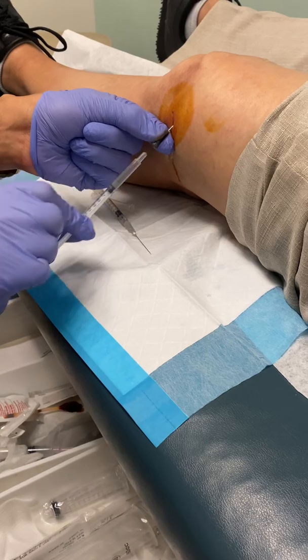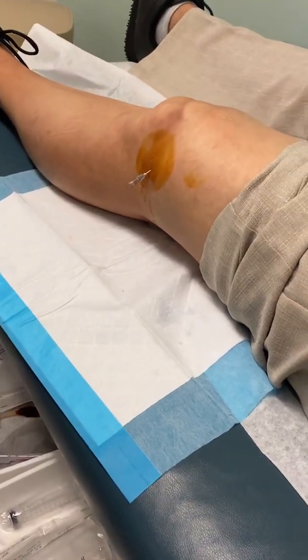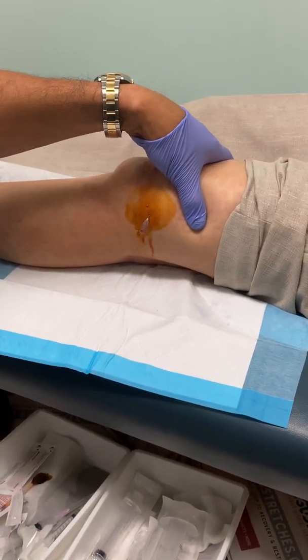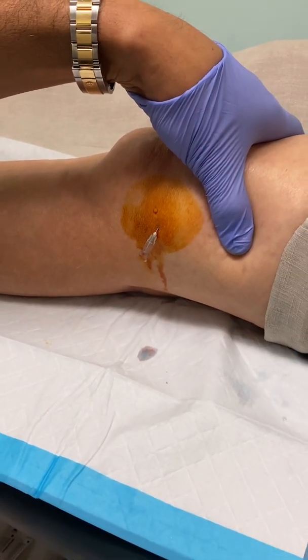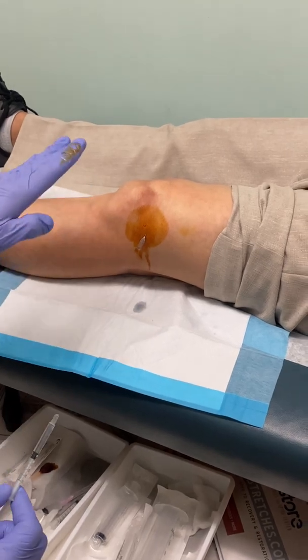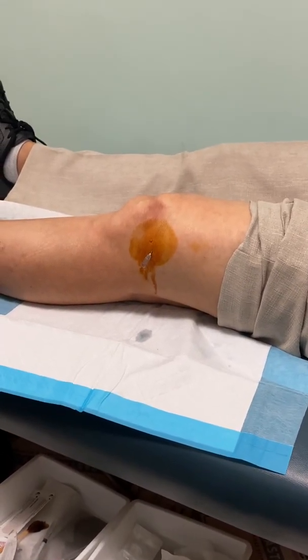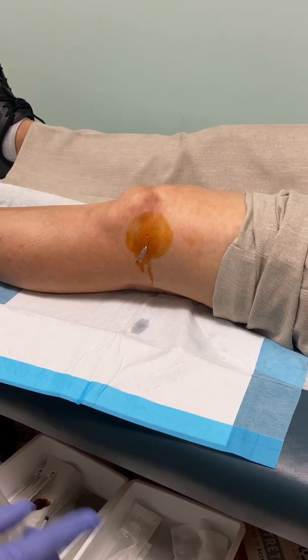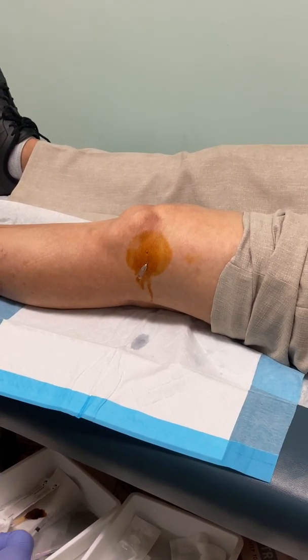Now this is the ultimate test. Take that off and watch what happens — zoom in, see? We're in the knee. So once again, the trigger is the lateral border of the patella. Take a low trajectory, aim high. I could have used my ultrasound — it was on standby, actually right here next to me — but I didn't. I was ready to, just in case.